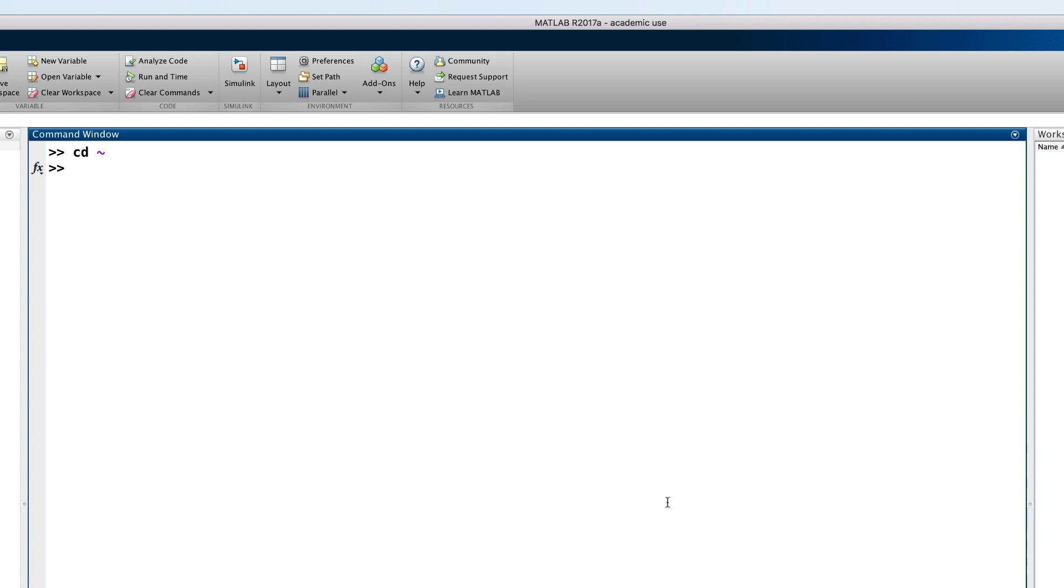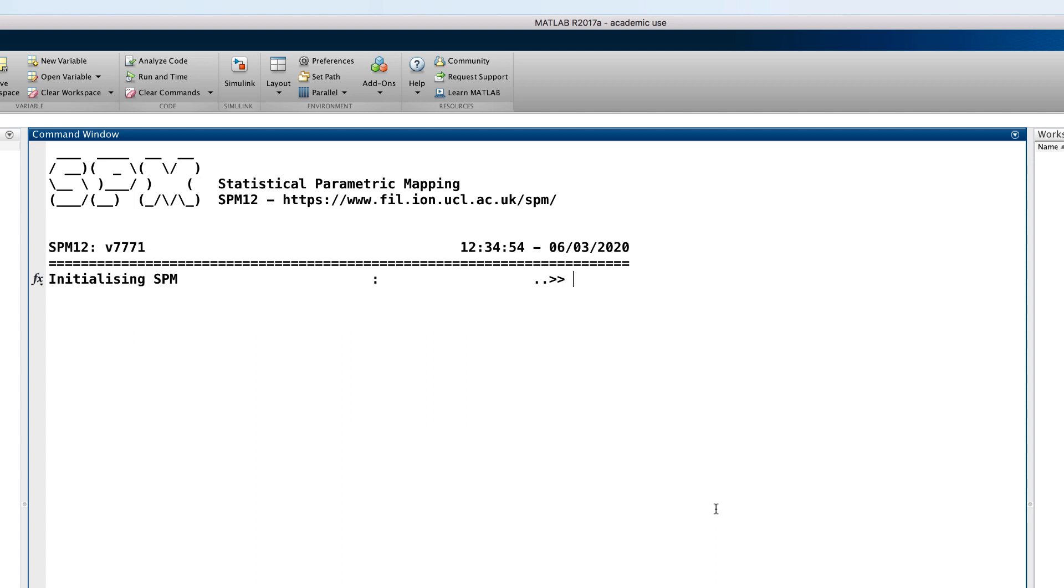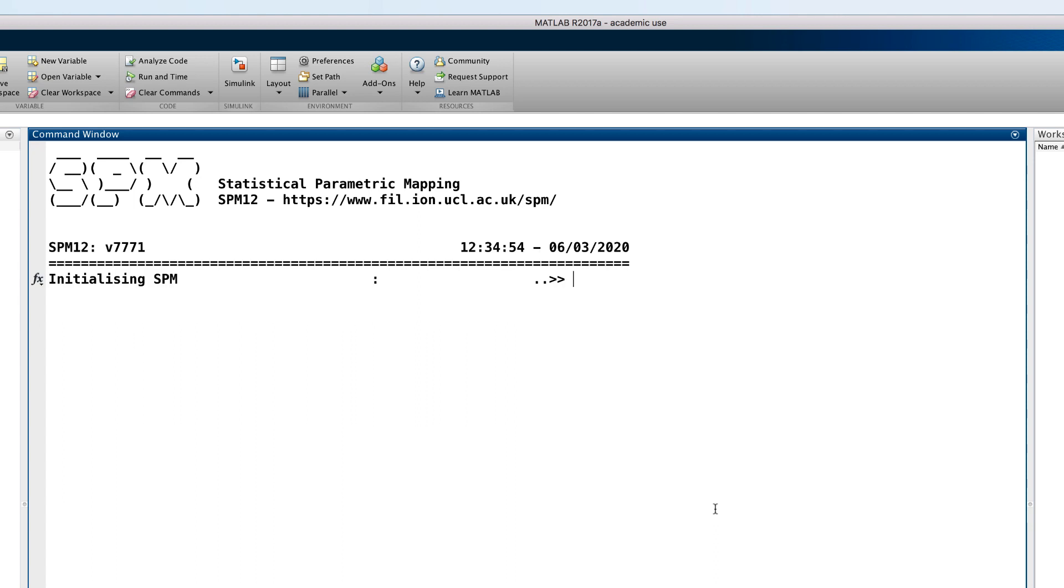After you have set the path, type the following from the MATLAB terminal: SPM, and press Enter, which opens up the following window. And then click on the fMRI button to open up the SPM fMRI graphical user interface.